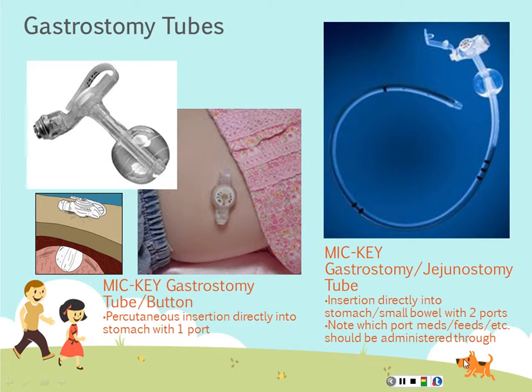To the right, you'll see the Mickey gastrostomy jejunostomy tube, and it's inserted directly into the stomach and the small bowel with 2 ports. One important thing to note with this one is which port the meds or feeds should be administered through. Sometimes they want meds inserted into the stomach, but they want feeds into the jejunum. So you always want to notice if there's a specific preference or order for where those should be placed.